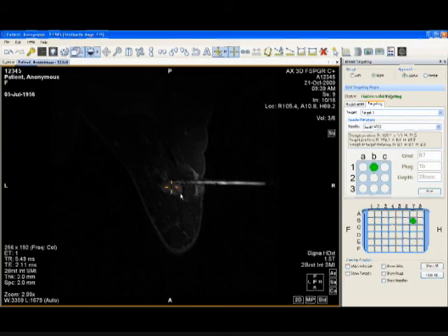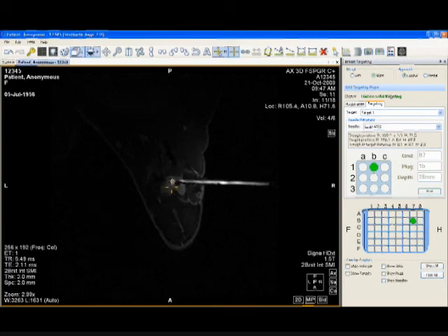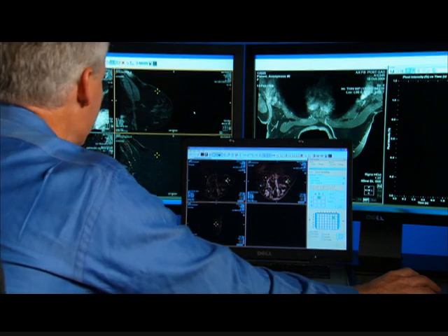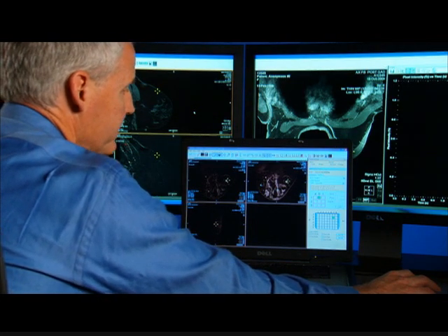You can see initially a cavity developed somewhat proximal to this. This is something not uncommon when you have an isolated lesion, particularly when it turns out to be malignant, sitting within fat. Even though your sample tray may be centered appropriately, you'll see fat getting withdrawn just because of the density of the lesion. At this point, we did a half sample, so we were only sampling from the obturator distally, and then you can see now there is a cavity resecting the lesion in both projections. This did turn out to be an invasive ductal carcinoma.